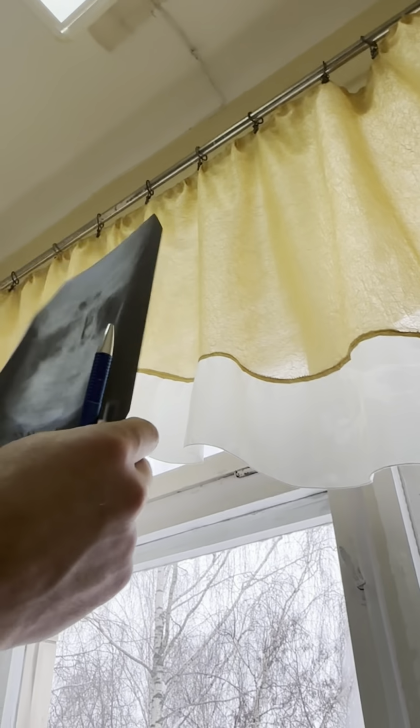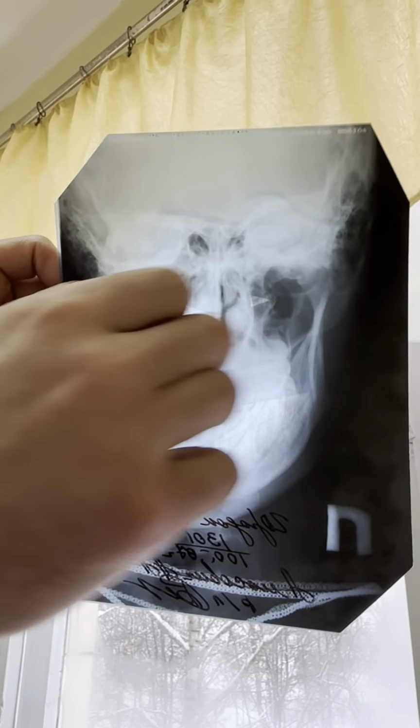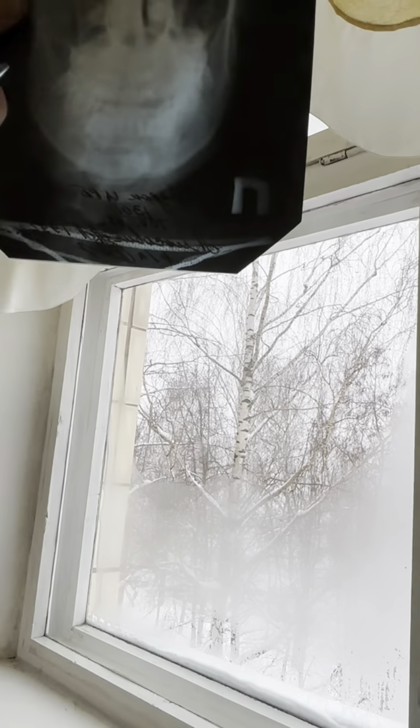No, we will see the fracture of the mandible here. Yes, this is a fracture. It's normal. The vertebra plus skull. That is why, what? This is the fracture of the mandible. See, it's here, right? Only here? Yes, only here. This one was fracture. Fracture. One line, two second line.